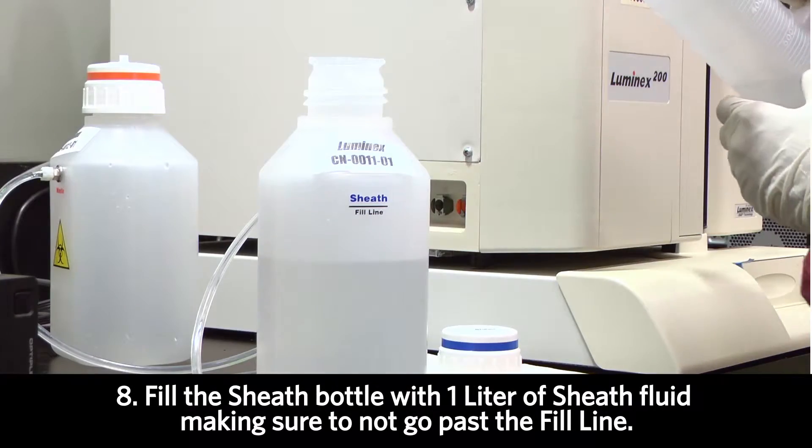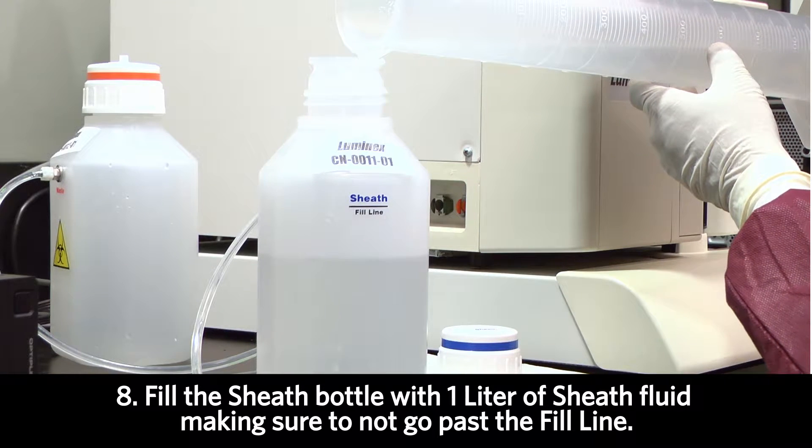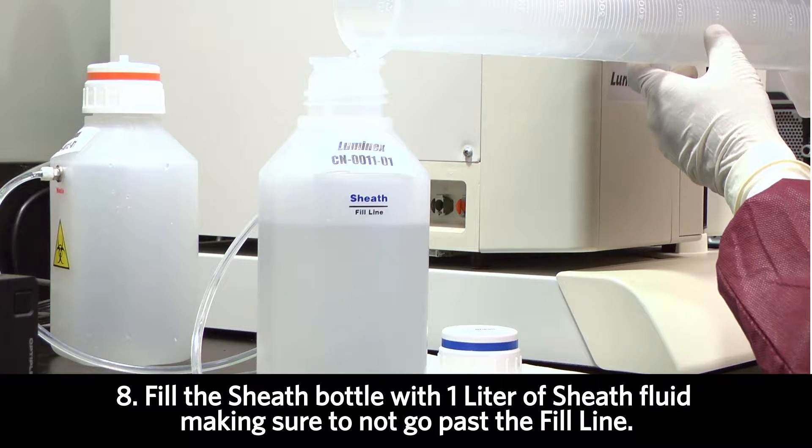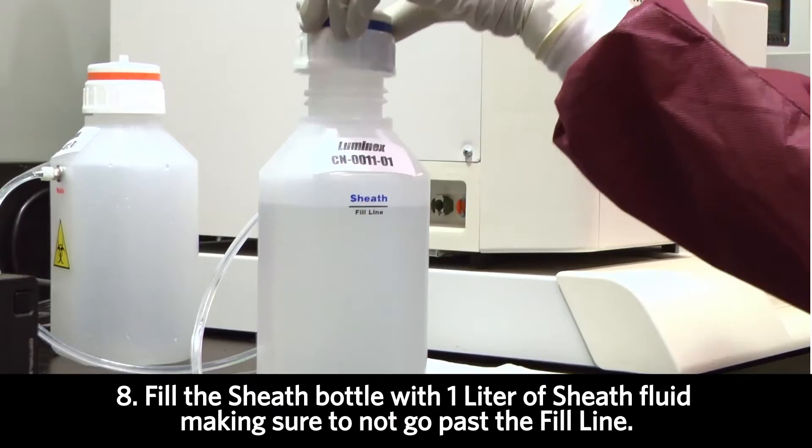The next thing to do is to fill the bottle with one liter of fresh sheath. There's a fill line and we should not go anywhere past the fill line when adding sheath fluid.